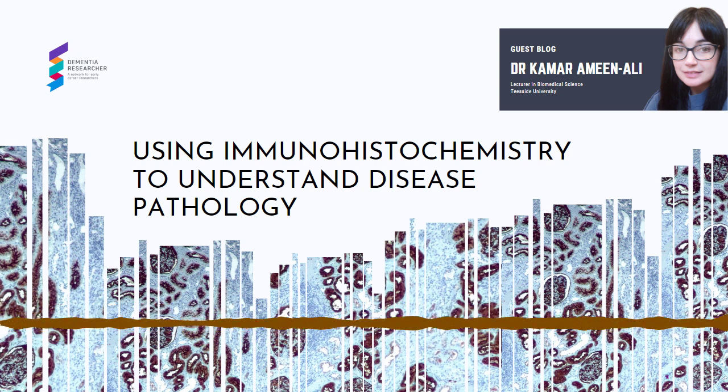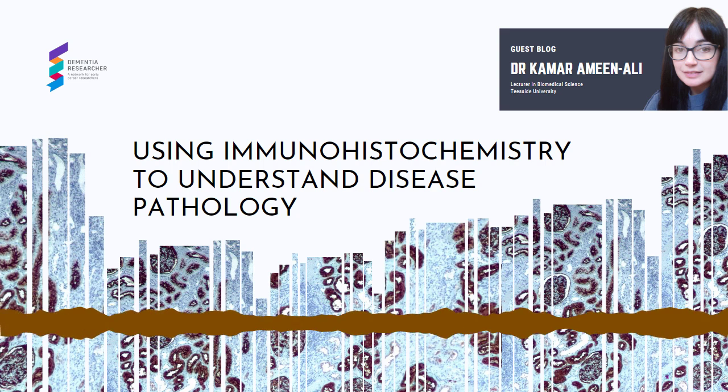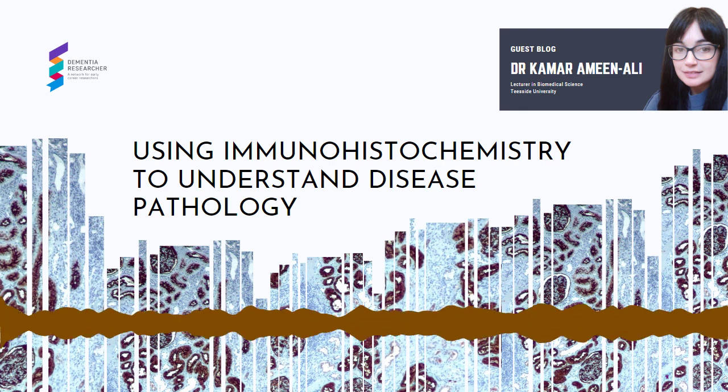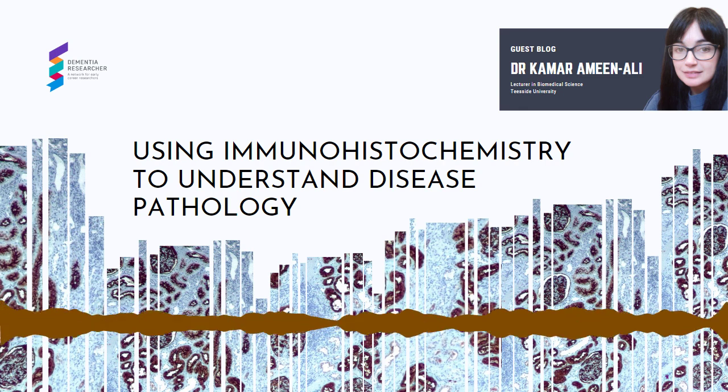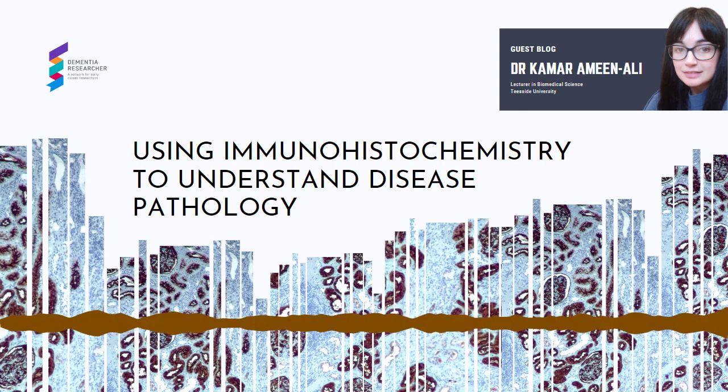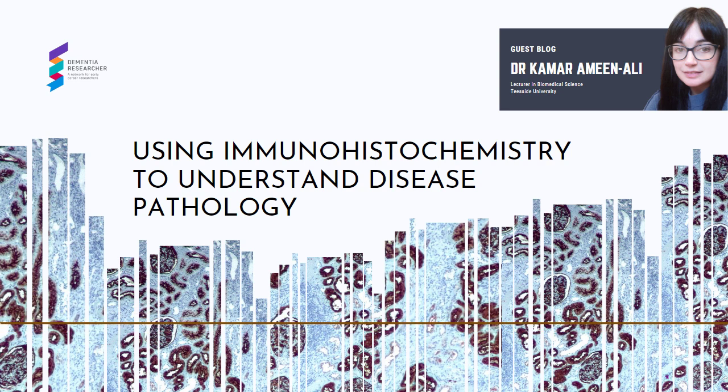Any basic immunohistochemical protocol will have the same core steps outlined above, but there is flexibility for some steps. For example, some protocols may require a primary antibody to be incubated at room temperature for 1 hour, but another may state that it needs to be overnight at 4 degrees Celsius, i.e. in a cold room or a fridge. This is even if in both cases the same antibody was being used on the same tissue. How can this be? Having worked in 3 pathology labs during my research career, I have never used the same protocols for the same antibodies when moving between labs.